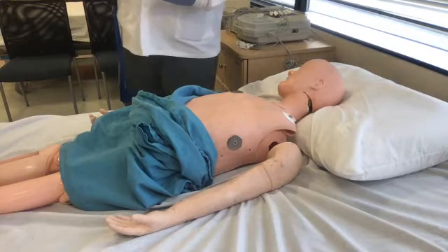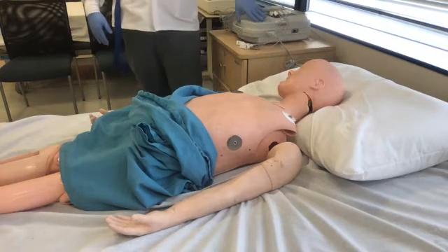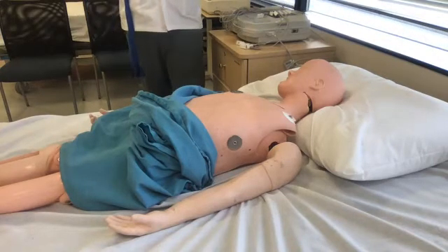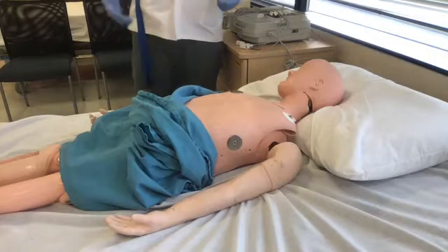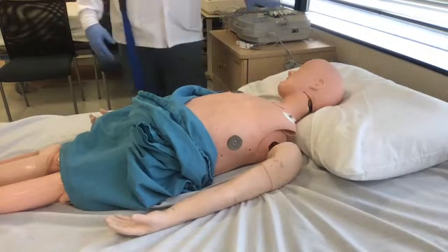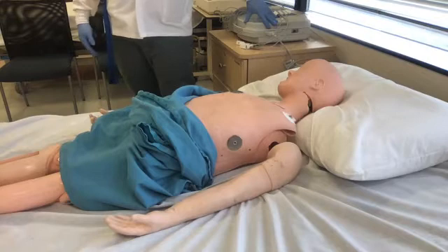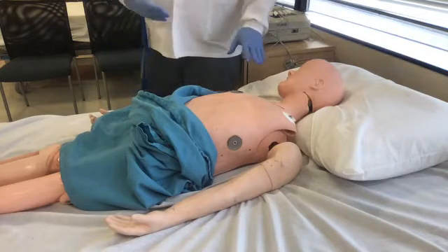Well, most cardiologists now, and also the hospital, you'll see they walk around with an iPad. But yeah, you could still use this, and then they get this, but eventually someone's gonna have to take that and scan it if you have electronic medical records. Right? Well, it's something to think about, because these things compared to the newer ones, they're relatively cheap. That setup I told you with the iPad, I know for a fact cost 12 grand. But you could see the advantages of having electronic medical records.